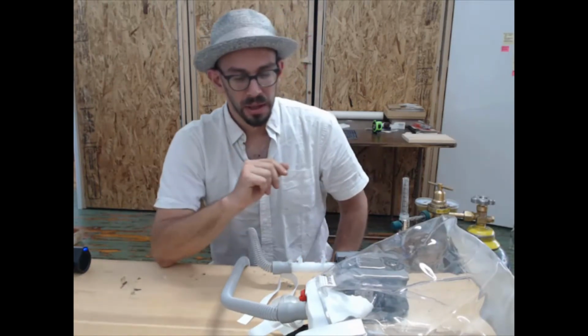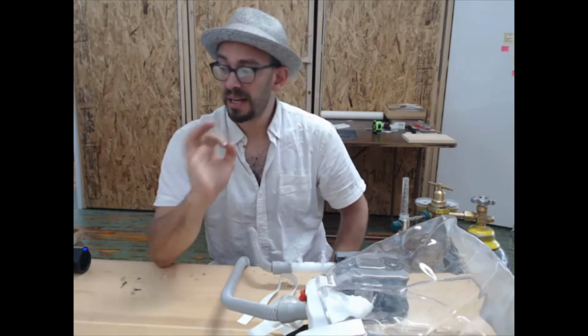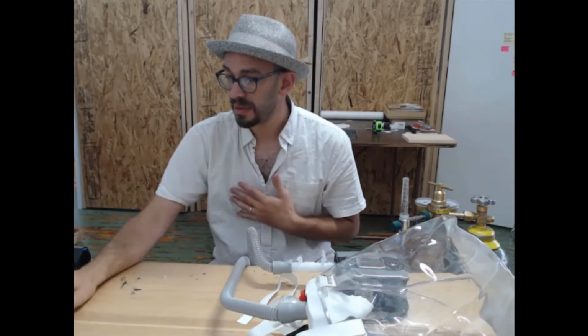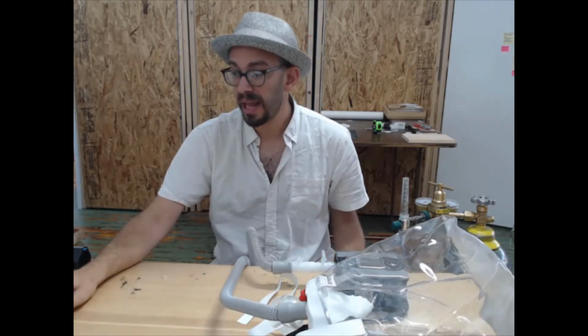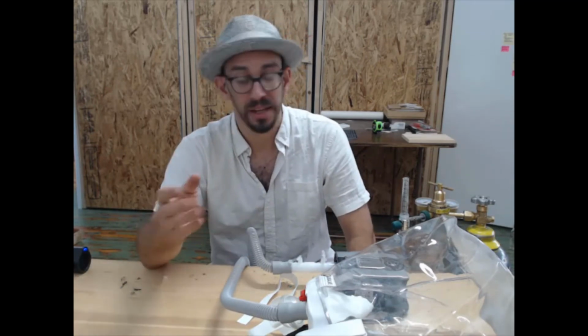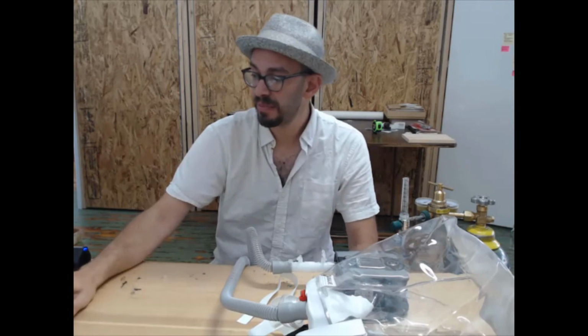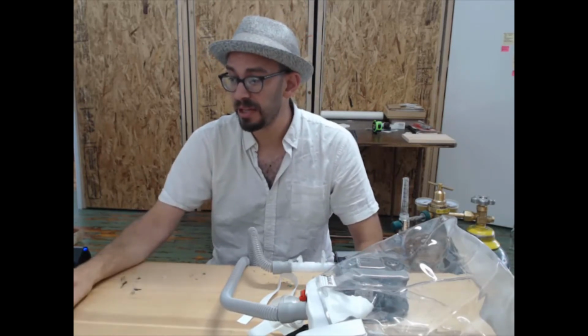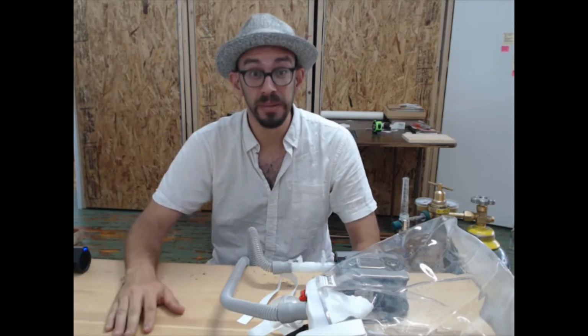Now, let's go ahead and pick an operating point. Let's say that I'm the attending physician, we have a new patient, and they're having some difficulty breathing, and they have low FiO2. They have low blood oxygen saturation. So I say, okay, let's start them off at 5 centimeters of water pressure and 50% FiO2.